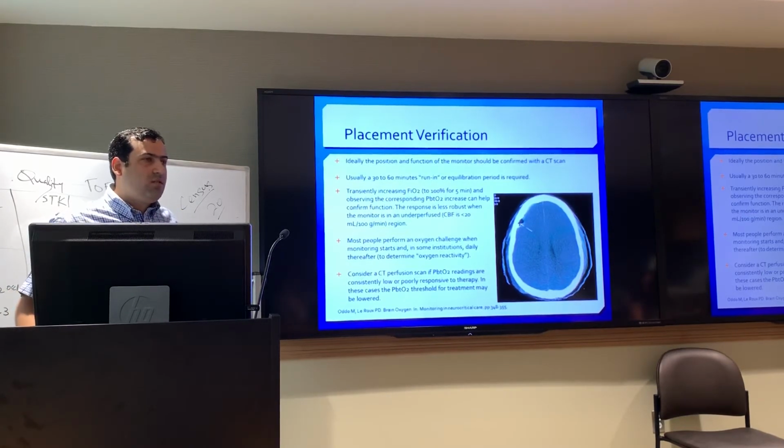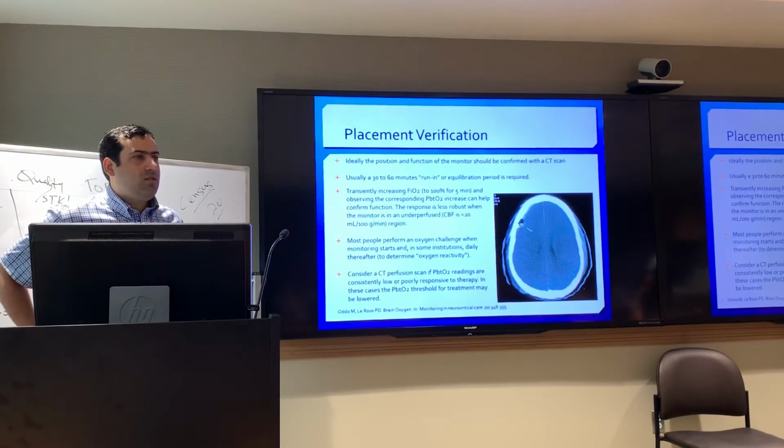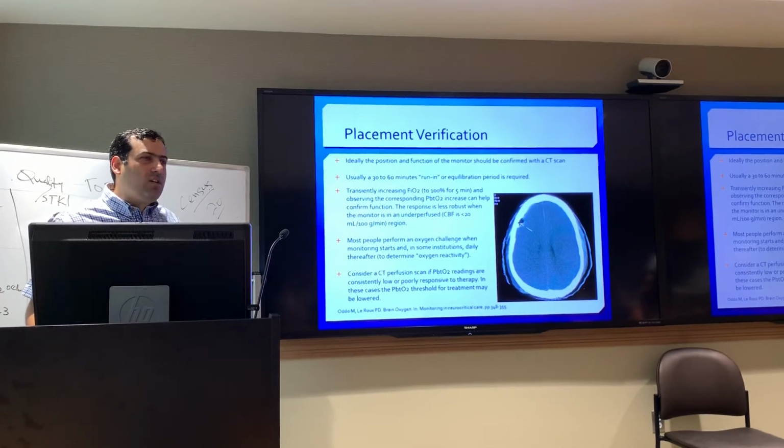We do see in the initial evaluation period, if you want to set 2 hours, we do see it's longer sometimes. Yeah, I feel like it's longer. But there are very few situations that I can think we need a PbO2 monitor more than 2 weeks. So we haven't come across that problem.